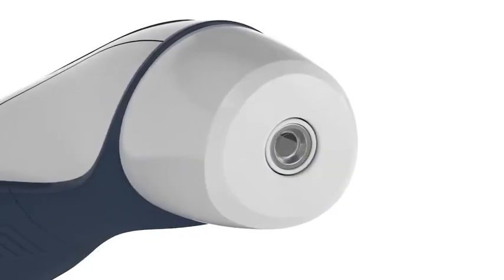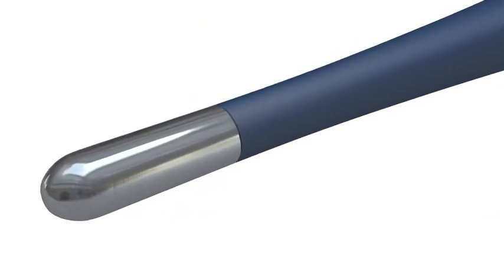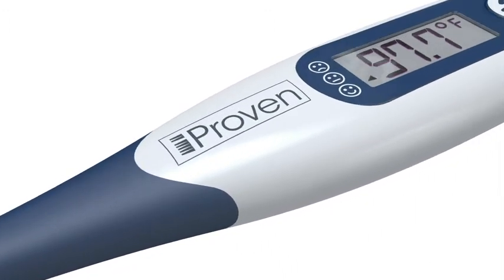Sometimes even the most accurate thermometer gives a temperature that seems unlikely or even absurd. Double-check the result with a rectal thermometer if necessary.